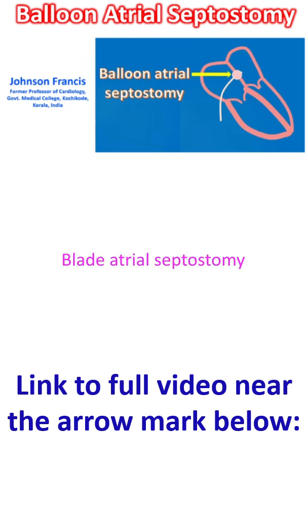A good defect will improve the mixing and consequently the systemic oxygen saturation, as more deoxygenated blood reaches the lung for oxygenation, unlike the pure d-TGA, in which hardly any portion of the systemic venous drainage is carried to the lungs for oxygenation. Adequacy of the septal tear is indicated by only minimal gradient across the interatrial septum after the procedure.